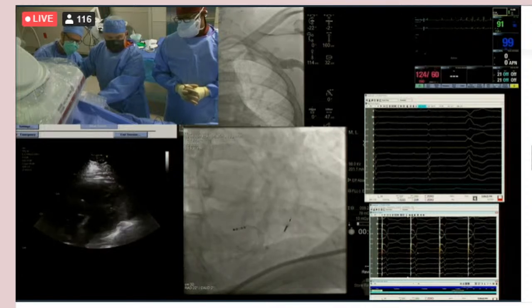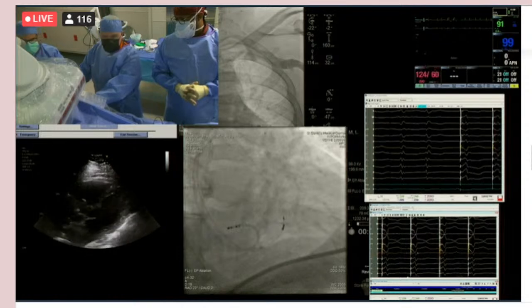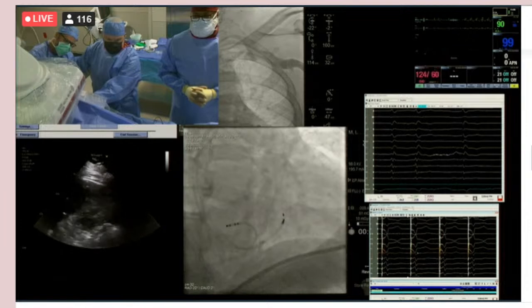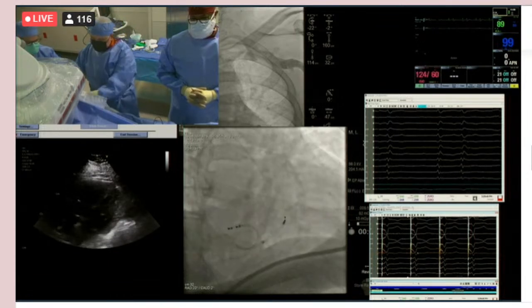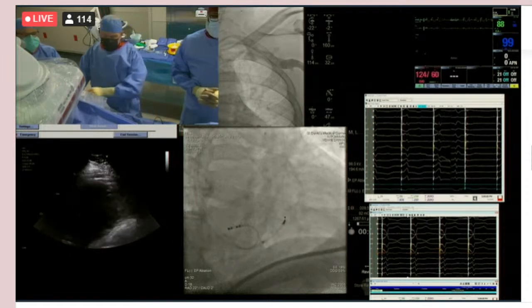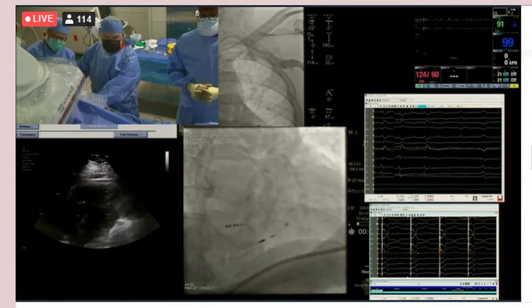Yeah, so there's a question. Do you use transthoracic echo for all of your left bundle cases, or is this just because this is EP Live? There's a few cases where we've used it, because as you're advancing the left bundle lead, you're checking the pacing impedance. If the impedance drops below 500 ohms, you frankly have to worry that you've penetrated the septum and the tip is sticking into the cavity of the left ventricle. So we've occasionally had cases where the impedance looked suspicious, and we used ultrasound just to confirm that we were not through.